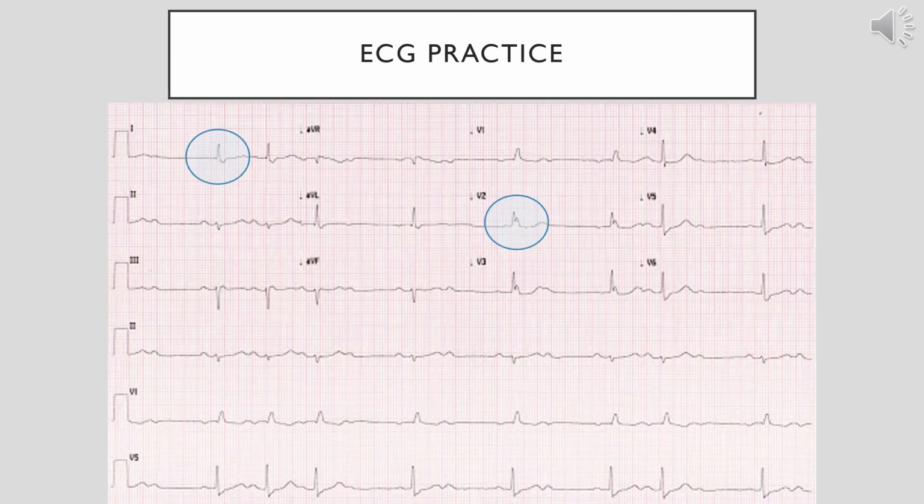I've circled a few of the items here on this EKG because I think it's a little bit harder to read this one. It's not as clear. So looking at this EKG, we go down to the bottom strip, just kind of looking overall. This bottom strip is actually V5, which gives us a pretty clear show of what's going on.